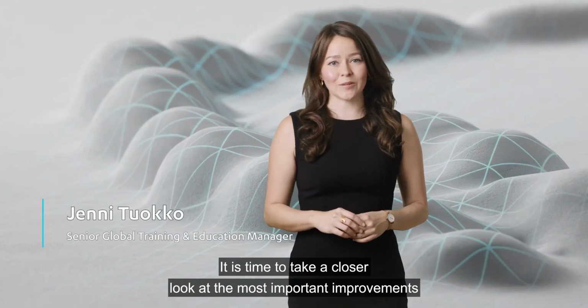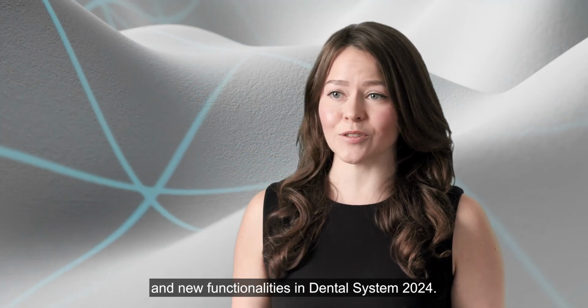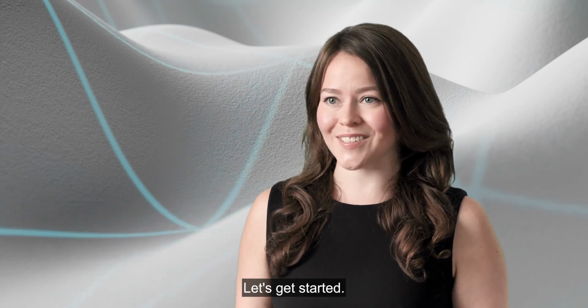Welcome everyone. It is time to take a closer look at the most important improvements and new functionalities in Dental System 2024. Let's get started.